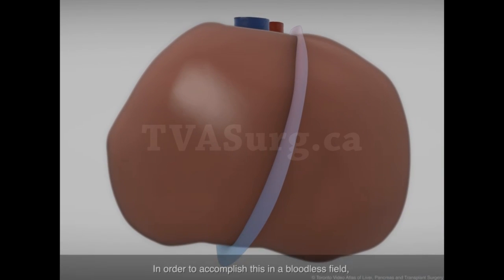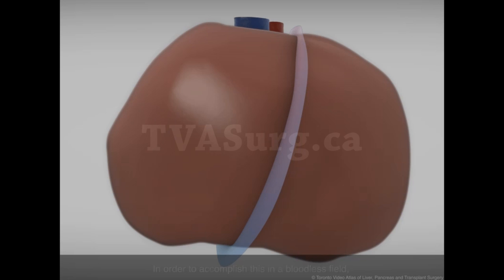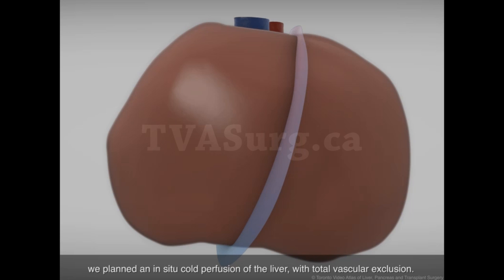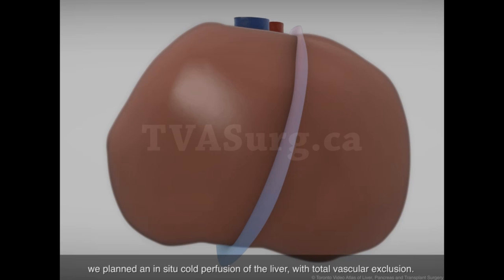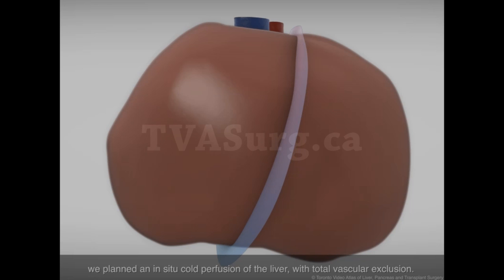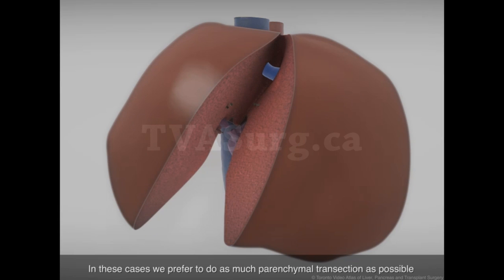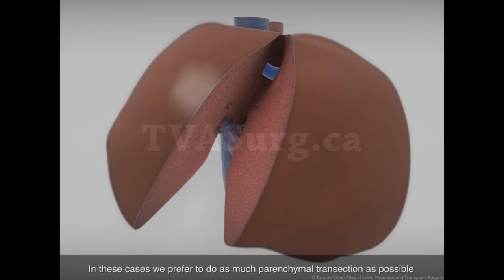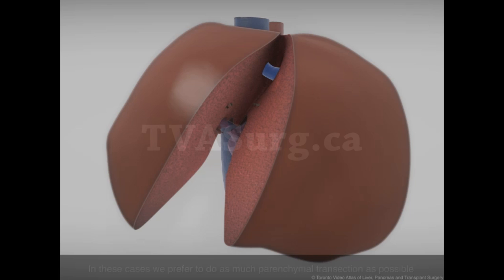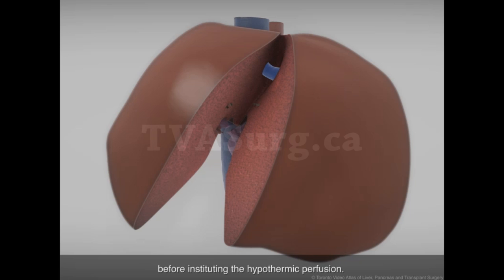In order to accomplish this in a bloodless field, we planned an in-situ cold perfusion of the liver with total vascular exclusion. In these cases, we prefer to do as much parenchymal transection as possible before instituting the hypothermic perfusion.